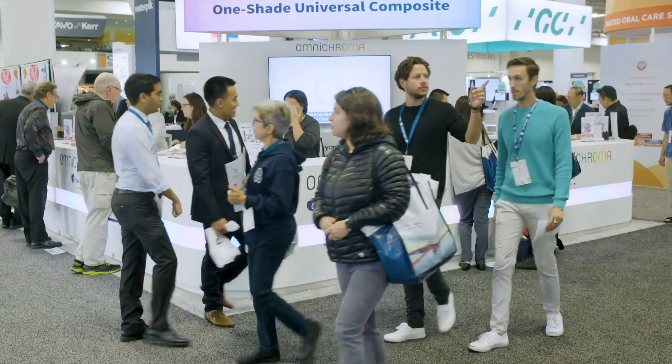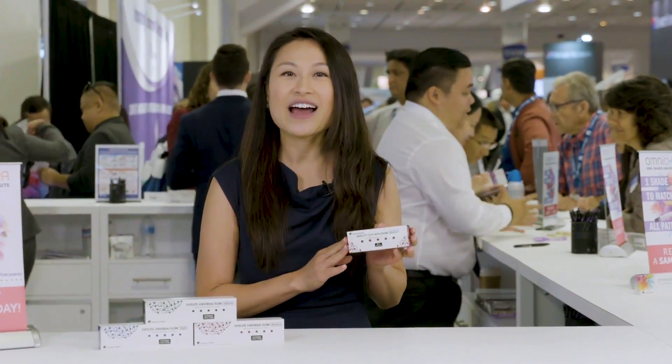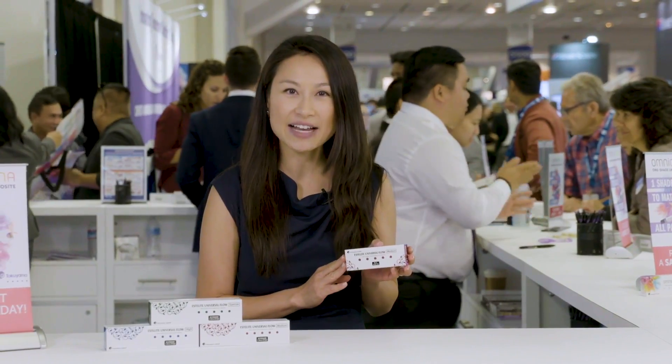We are here in the Tokoyama Dental booth getting a first-hand look at S-Lite Universal Flow, a new composite combining the handling of flowable with the versatility of Universal Composite. Let's see what people like you have to say.